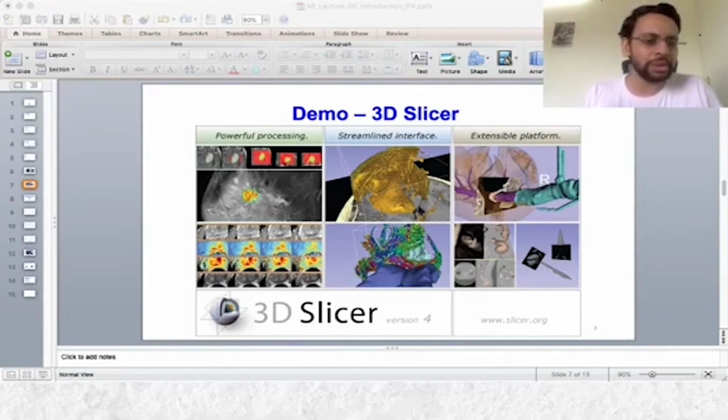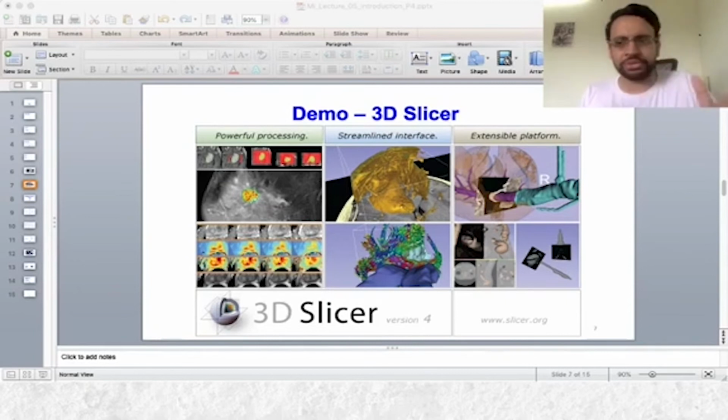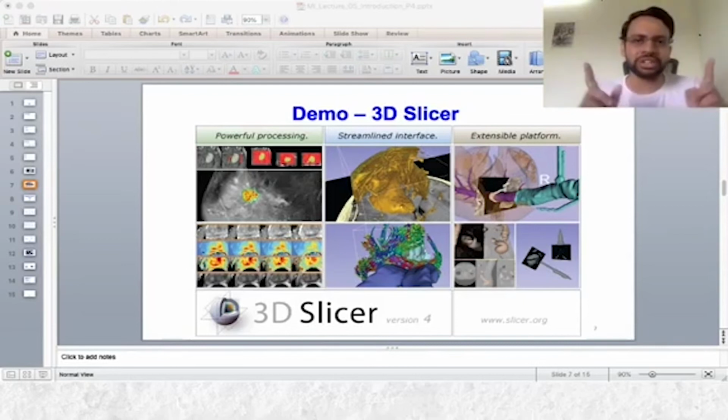You want to resample your image, you want to analyze the image in the frequency domain, you want to extract the surfaces of it, you would like to perform registration. Registration has again different modules, for example the type of metrics you are going to use, and at what resolution you would like to do, what are the types of transformations you would like to use for performing the registration, type of interpolators, type of optimizers, a lot of things. You could pick each module that you would like, and then you could write a very nice program here. This follows the concept which is commonly referred to as extreme programming.